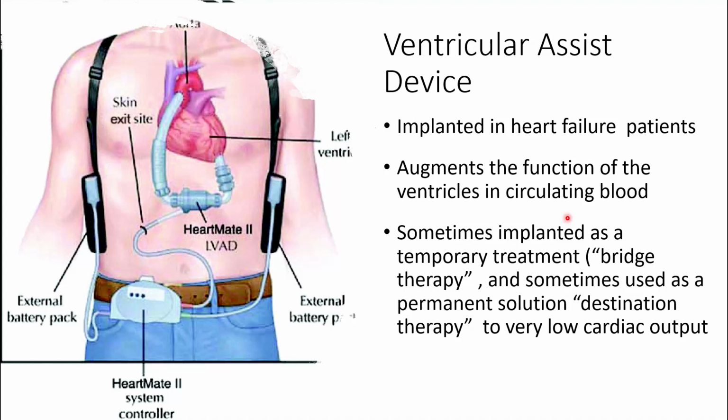And something that's relatively new in the past 10 years is the concept of destination therapy. In other words, these patients aren't candidates for heart transplants for one reason or another, either structurally or due to age or other concerns, and they will have these LVADs in one form or another for the rest of their life.